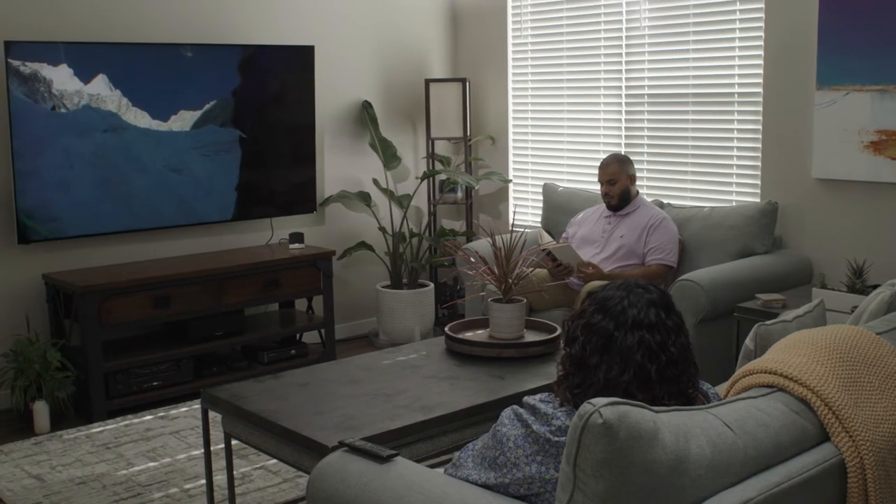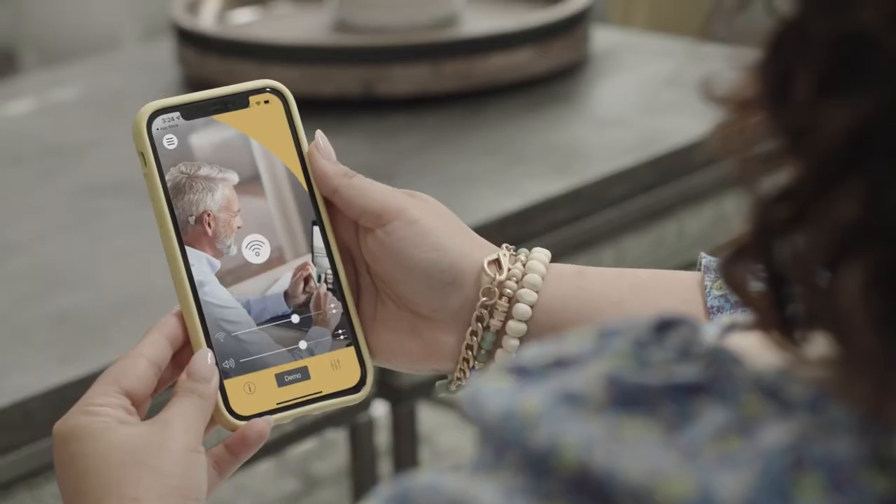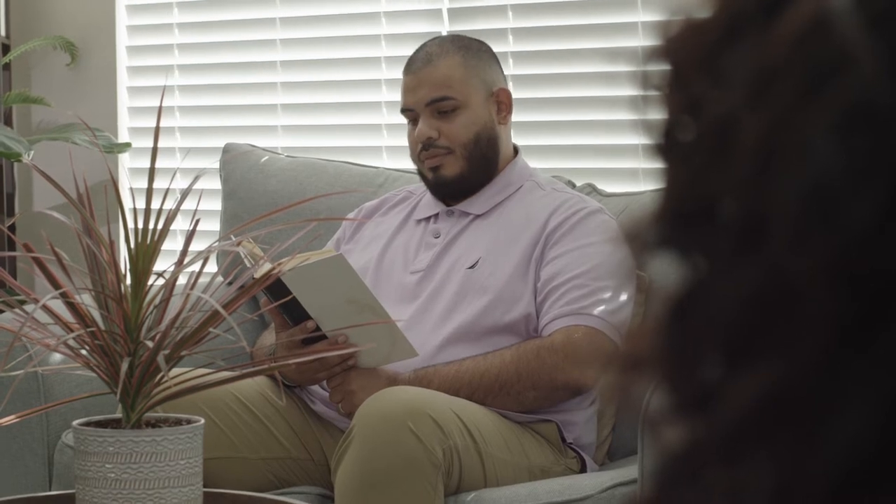You can use the Cochlear Wireless TV Streamer to hear the TV directly through your sound processor at your own comfortable volume, while other viewers in the room can hear the TV at their preferred volume or not at all.